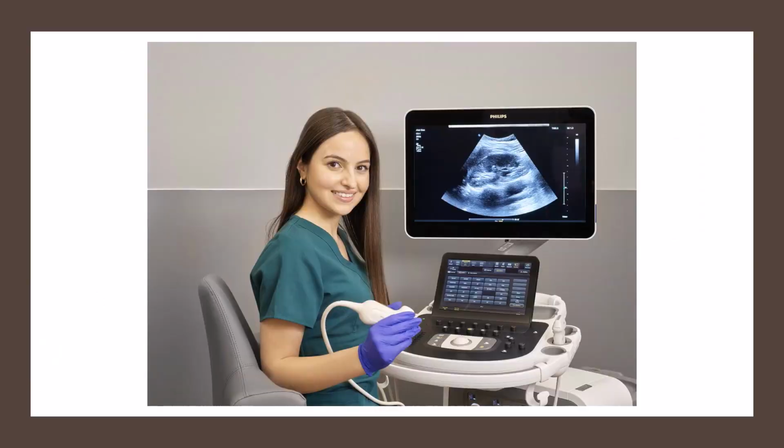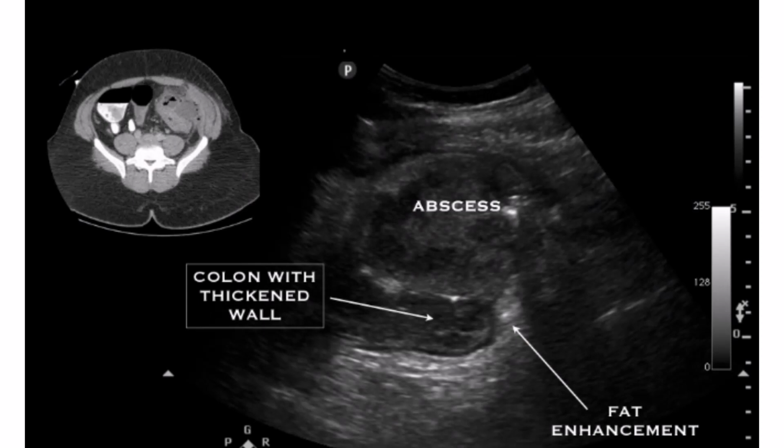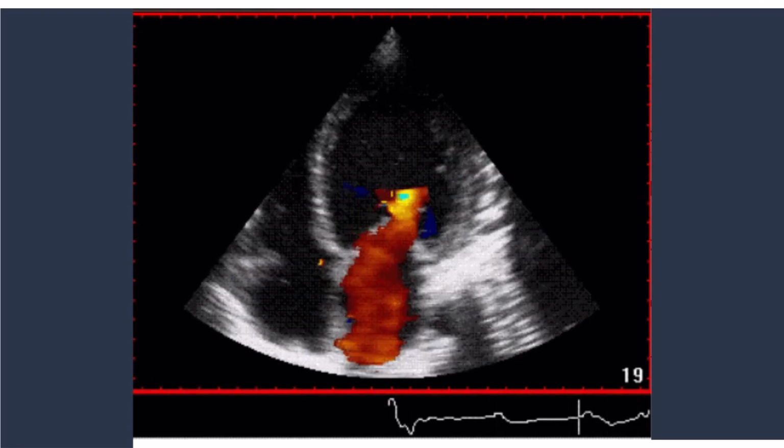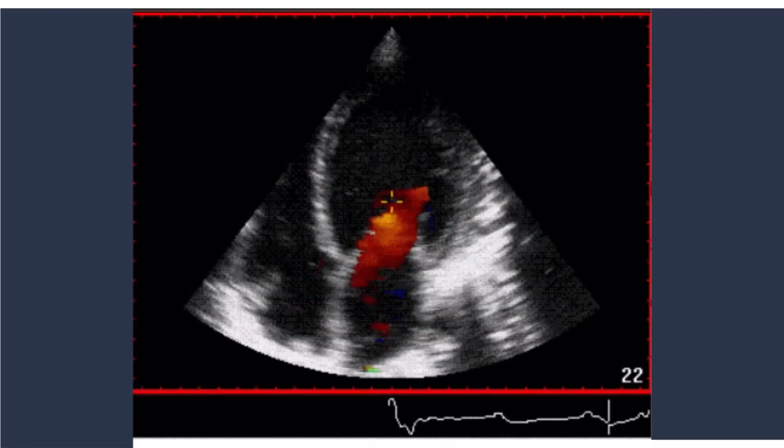Ultrasound has often been used in lieu of ionizing radiation. There are several specific clinical situations in which ultrasound cannot be used around structures of bone, etc., but it is a viable option for soft tissue imaging. Unlike MRI, the equipment is portable and relatively inexpensive. It has found a particular place in imaging of pregnancy, but is also used to image the liver, spleen, and other organs within the body. Ultrasound also plays an important role in the investigation of heart and blood vessels.